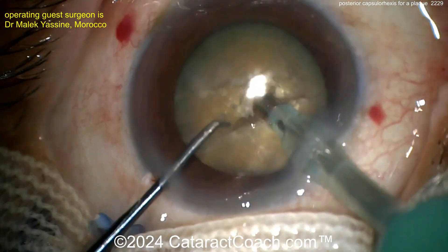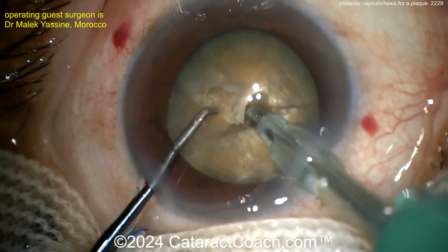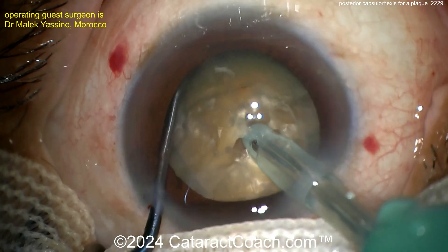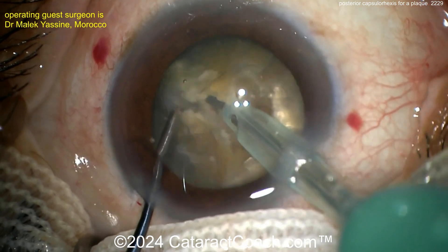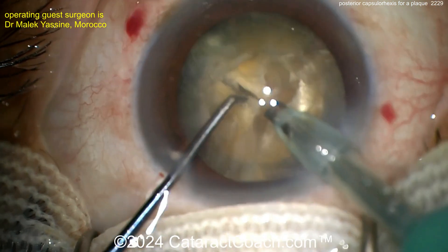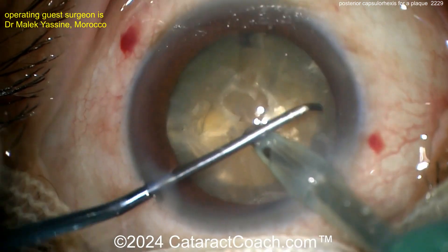Going back inside the eye, rotate again. Get the probe buried deep in the nucleus and the densest part of that nucleus. Chopper going around the equator and a nice chop. Beautiful technique here — this is fantastic. Great job for this young surgeon.